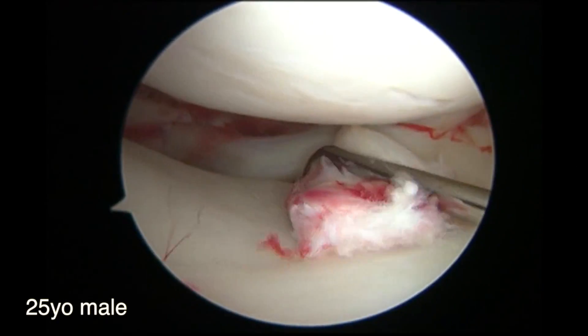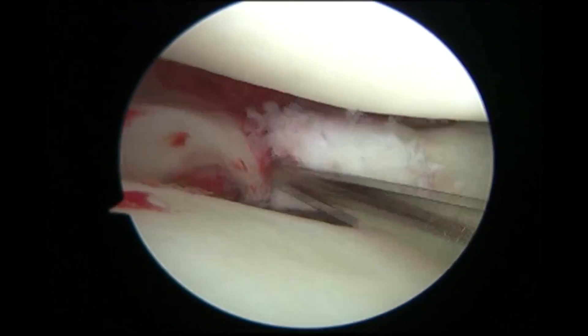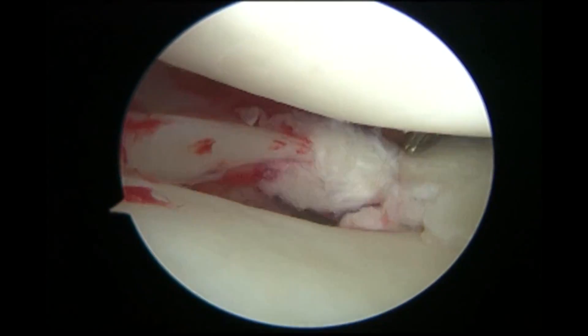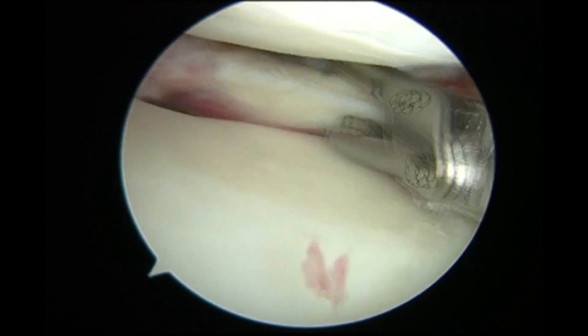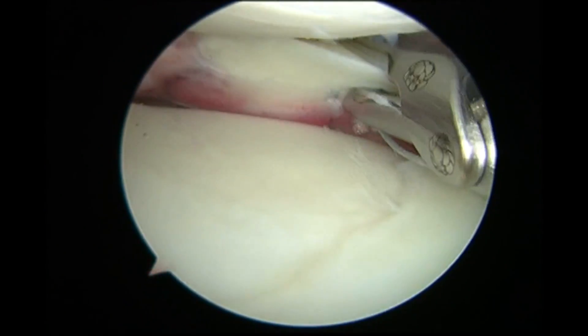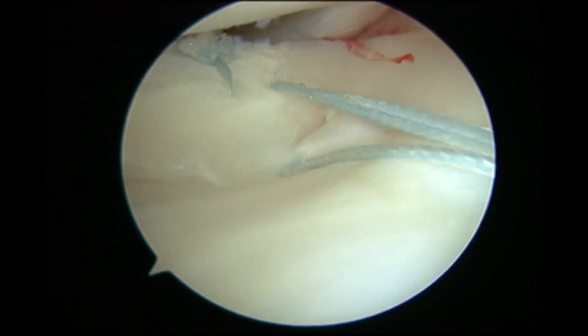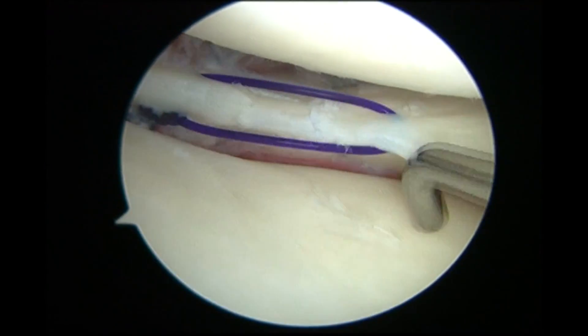The first example is a 25-year-old football player with a radial tear at the lateral meniscus at the popliteal hiatus. The popliteal artery nerve was right behind that root stump, and you can see the popliteus in the background. The lower jaw is extended underneath the meniscus, and sutures are passed from lower jaw to upper jaw where it's atraumatically self-retained. Then the lower jaw is retracted and the device removed. In this case, I passed three side-to-side sutures, secured the central ones with PDS, and trimmed a little bit of the white fringe at the border. At eight months post-op, he's asymptomatic and wants to go back to football, so I did a second-look scope which confirmed healing, and he successfully returned to sport.